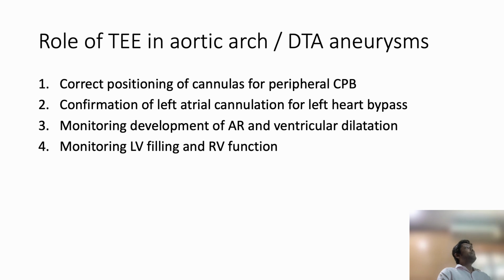And monitoring the development of AR and ventricular dilatation, because the ventricle is acting under a cross clamp condition at that time. So ventricular dilatation, that is LV dilatation, is very common at that time, and monitoring of LV filling and RV function as well.